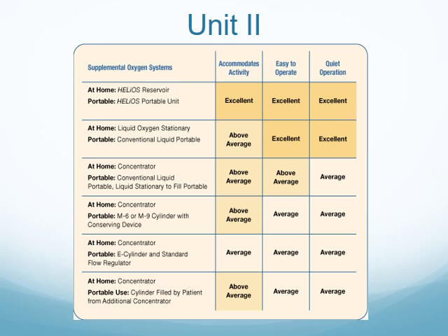In this slide, you can just see all the different types of supplemental oxygen systems, how well they work, how easy they're able to operate. And you need user friendliness when you're dealing with a patient or a family member, because a lot of them don't understand a lot of things. So the easier you can make it for the home setting, the better.